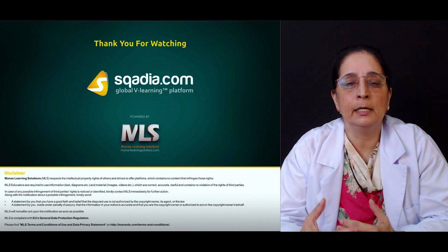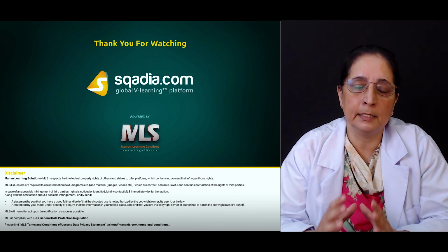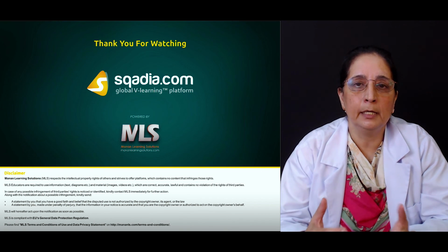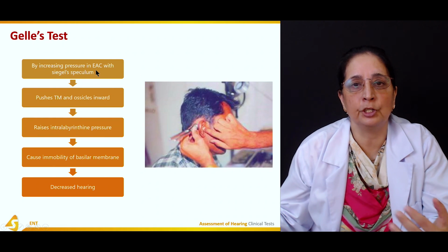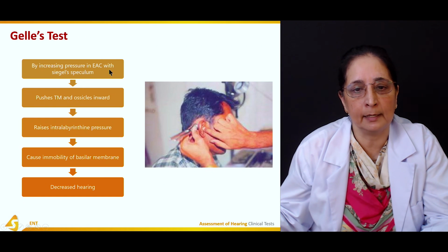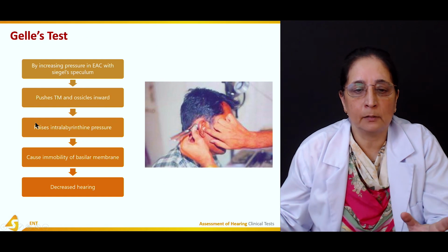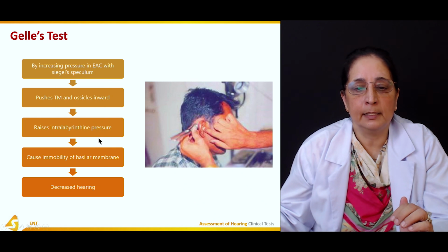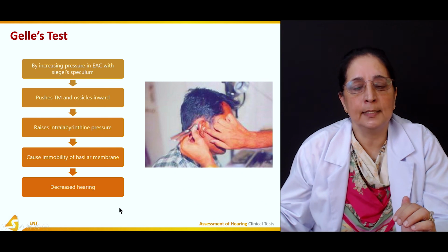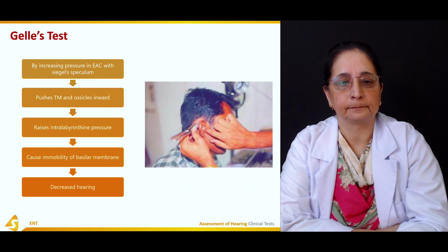So Gelle's test is the test in which increased pressure in the external auditory canal with the help of a speculum causes increased pressure in the inner ear, and this can cause decreased hearing.